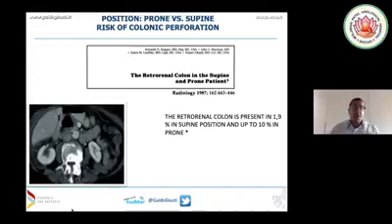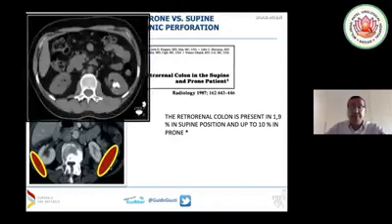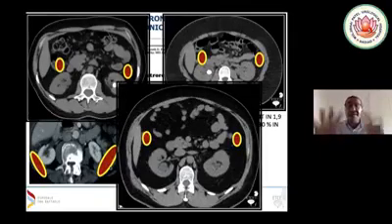So if you look at this picture, of course, if you have a case of retrorenal colon, like in this case, you see completely retrorenal colon on both sides, this is for sure not an ideal case for supine PCNL. But as reported in this paper in Radiology back in 1987, look at that. Retrorenal colon is present in 2% of patients in supine, while it's present in up to 10% in prone. I'm sure that not many urologists read this paper at that time, meaning that the majority of our patients have the colon far away from the trajectory of our PCNL. Look at this, these are normal cases in which the colon is clearly far away.